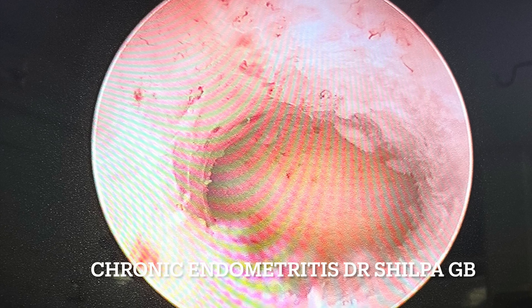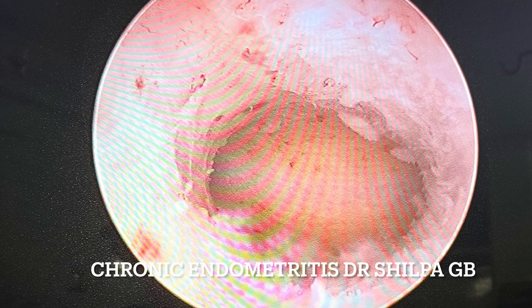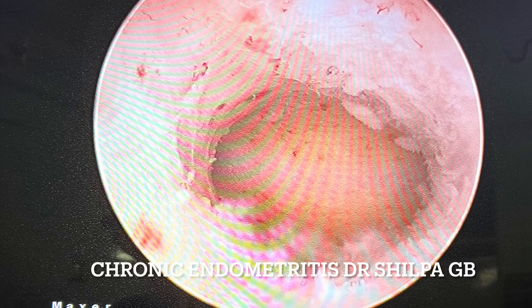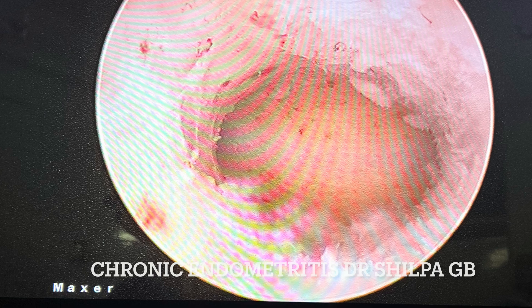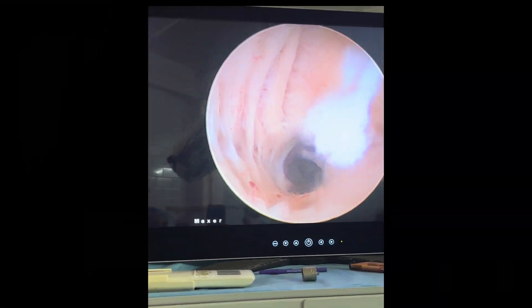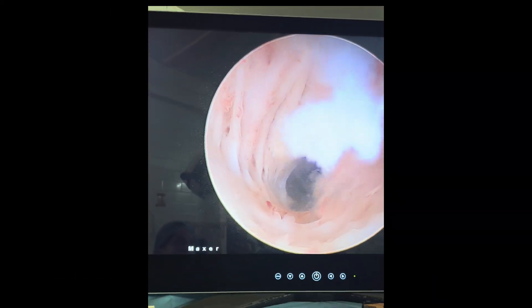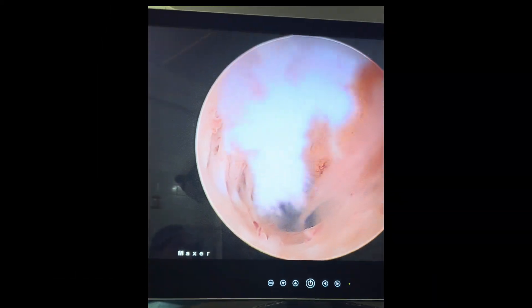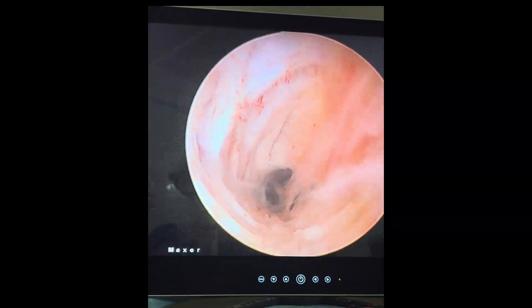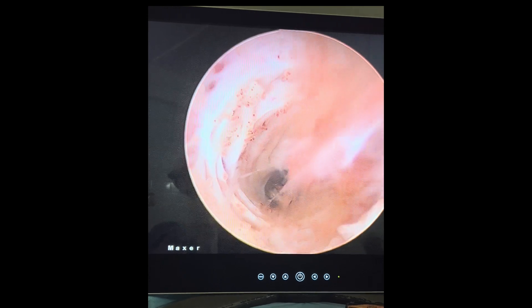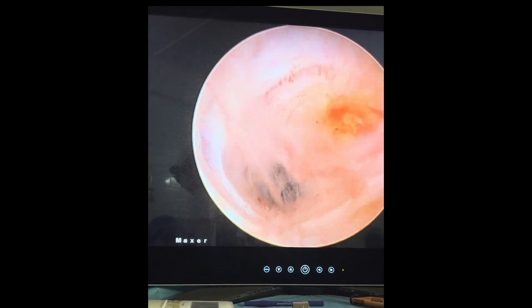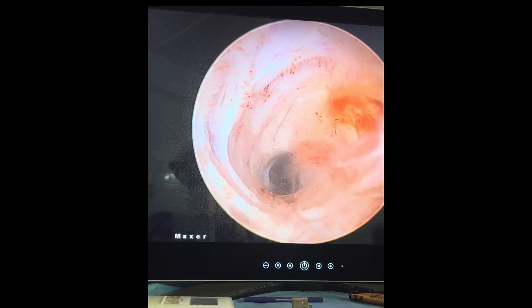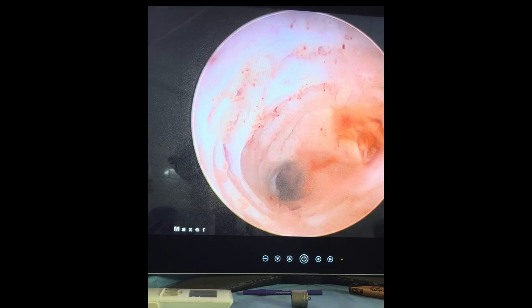This is today's hysteroscopy, done for implantation failure in an IVF patient. In yesterday's class we discussed that the commonest reason for recurrent pregnancy loss in the Indian population could be chronic endometritis, which we should suspect in certain clinical presentations.